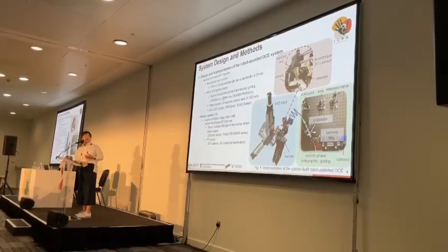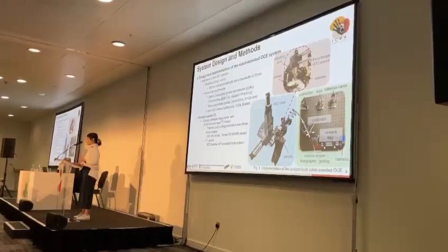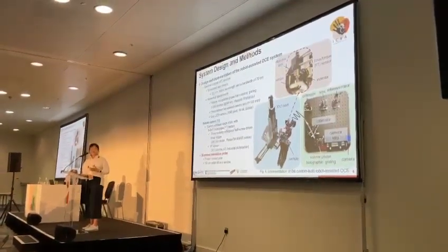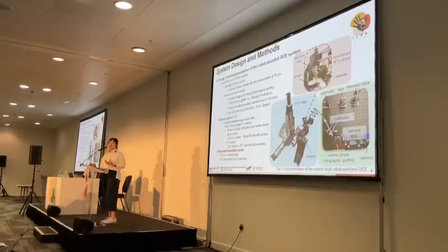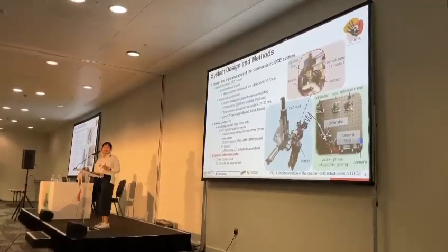The robotic system is a custom Cartesian stage robot with a 6 degrees of freedom force torque sensor attached to the end effector. And we designed a plastic probe mounted to the force sensor for tissue indentation, which has a channel for the OCT scan beam.